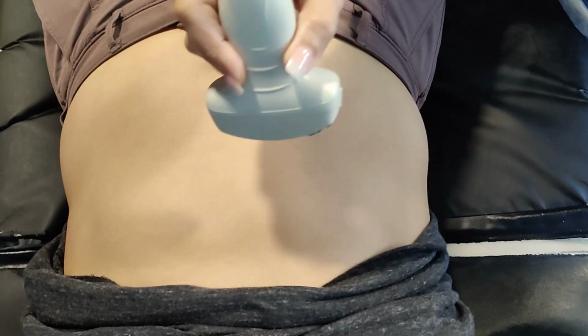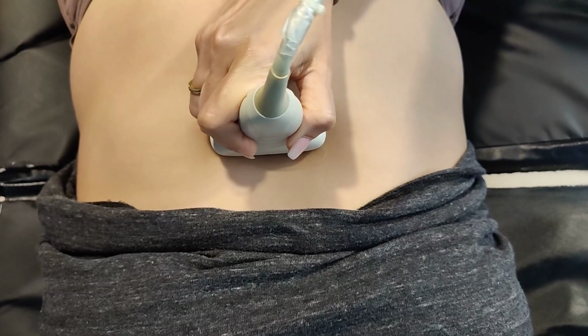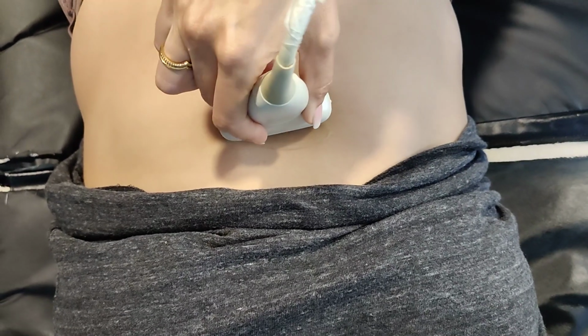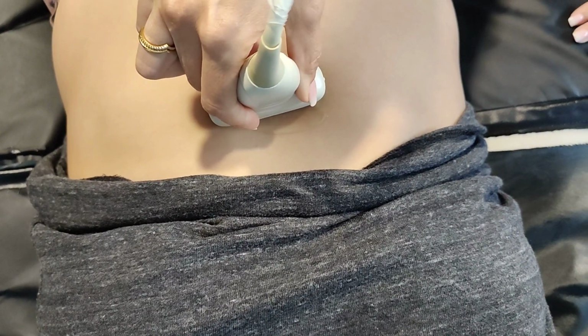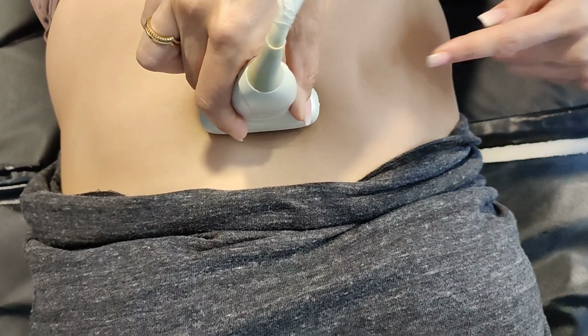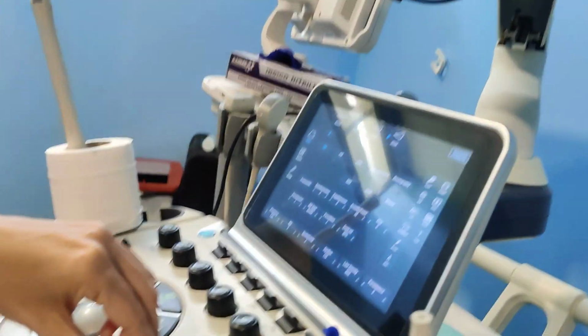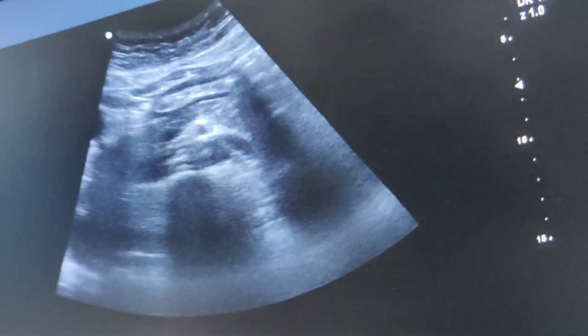Or pancreas. Yeah, transverse, epigastric area, right under the sternum. And your probe is slightly oblique, not perfectly transverse. You want to turn the notch down just a little bit. And we can look at the screen. I'm just going to increase my depth.